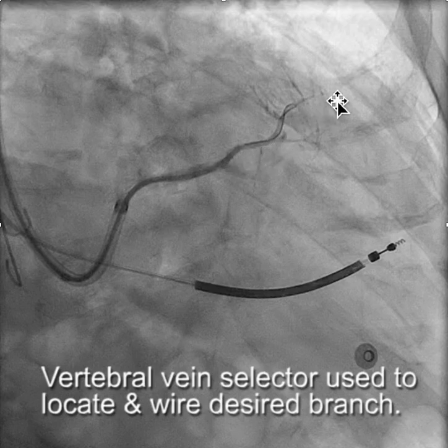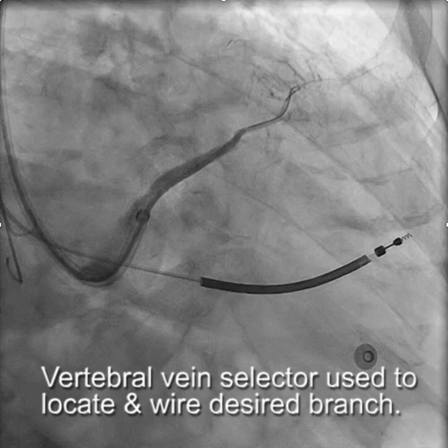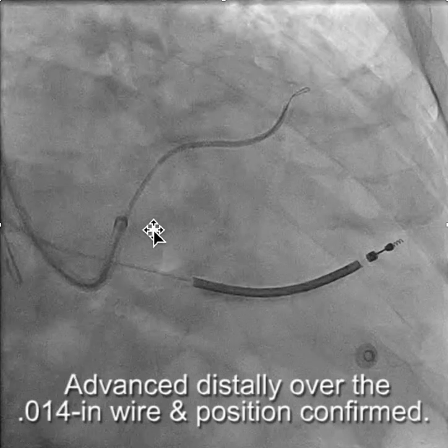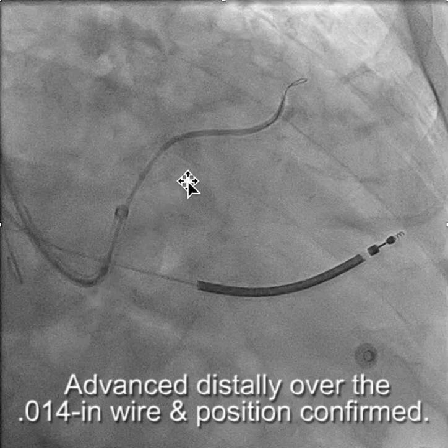From there we can advance a wire, then advance the vein selector even further into the branch over a 0.014 inch wire, then advance the subselector over that, and then put the lead in.